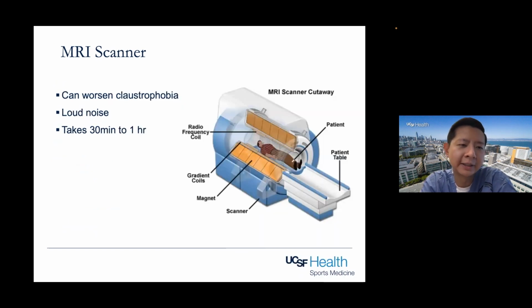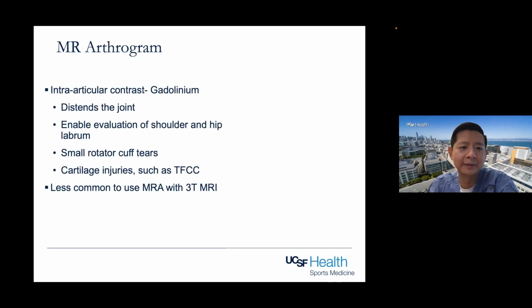The MRI scanner can definitely worsen claustrophobia if the patient has that. There's loud noise, and it takes 30 minutes to an hour, and for the most part you're inside this tube for that whole time. So it's something to advise your patients about in terms of the scan itself.